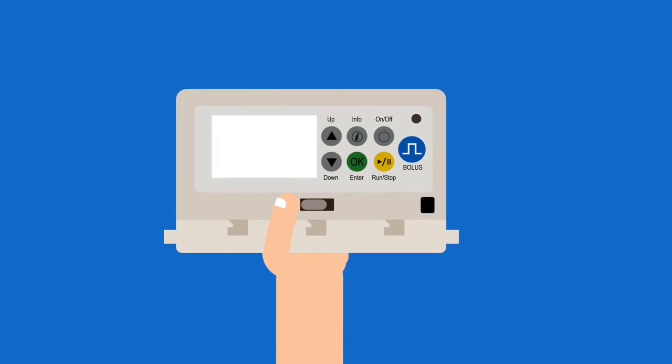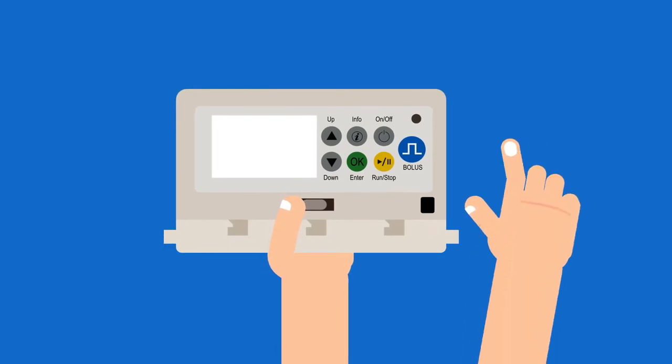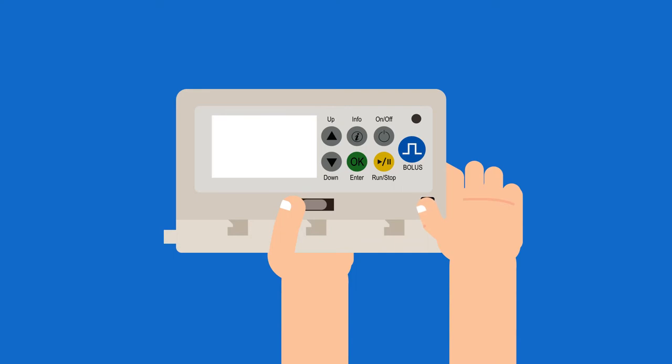Step 2: Detach the tubing from the pump. This is a two-handed motion. Use one hand to press and hold the black button at the bottom right corner of the pump while using the other hand to slide the metal bar towards the black button at the same time. This will disengage the tubing from the pump.